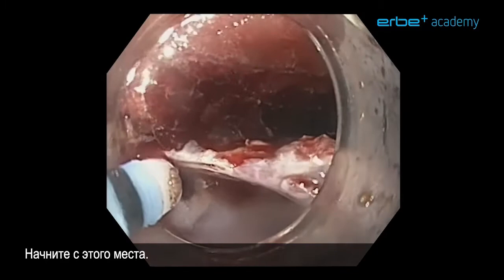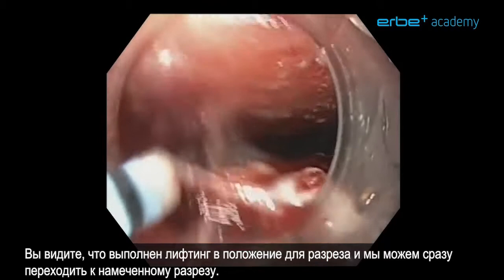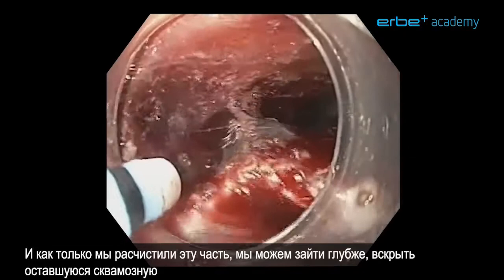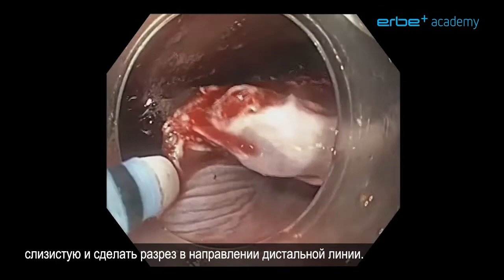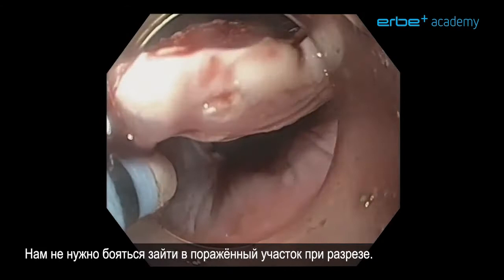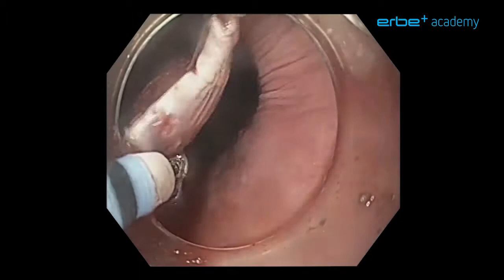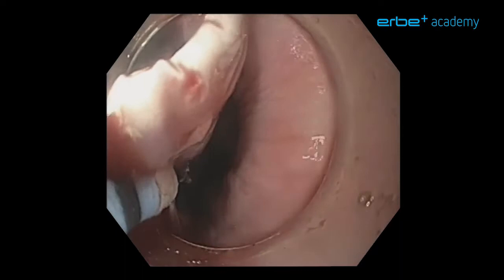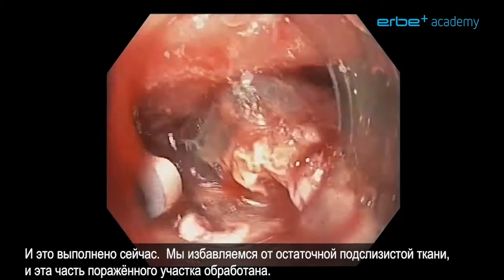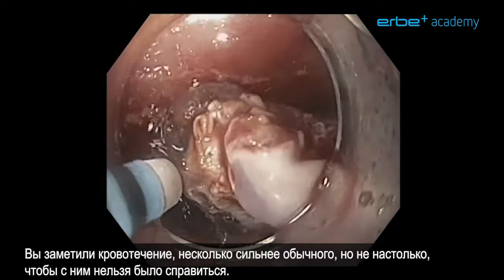First of all make a start. Here you see a nice lifting in position ready to cut, so immediately we can continue with the intended cut. Once we've cleared this part we can crawl under, cut open the remaining squamous mucosa, and cut towards the distal line. You can see the markers so we have good control of what we're doing — no need to be afraid that we're cutting into the lesion. Stepwise lifting and cutting we're approaching the distal resection margin. And that's done now — we get rid of the rest of the submucosal tissue and this part of the lesion is done.